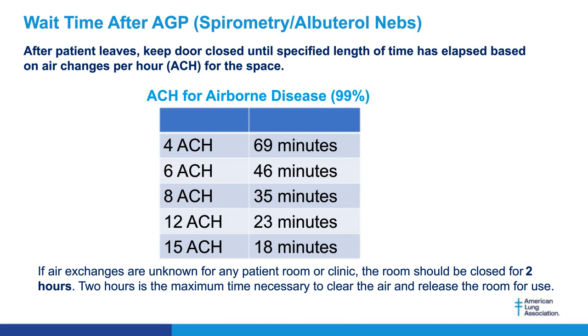The air exchange rates, basically what happened is we hired a person to come into all of my laboratories throughout the entire University Fairview system to measure the air exchange ratios. Basically what they're doing is they're measuring the amount of air coming into the room, the amount of air that's leaving the room to get the air exchange, the ACH, right? And they're also measuring the pressure difference inside the room compared to outside the room.